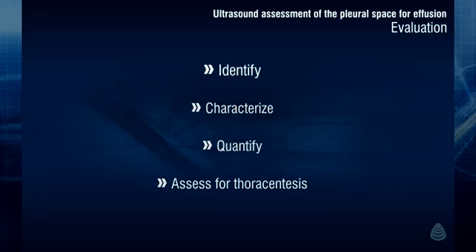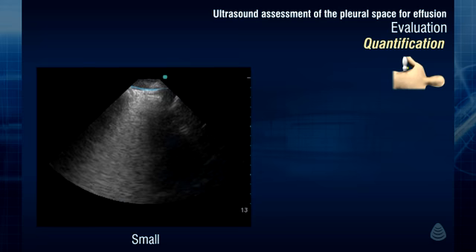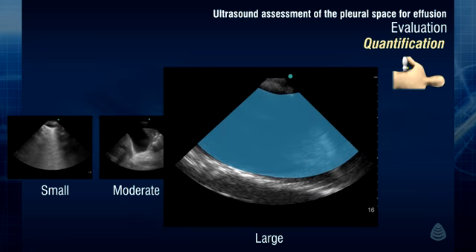In addition to the identification and characterization of a pleural effusion, the bedside sonographer should be able to perform a semi-quantitative estimation of the amount of fluid present. In most circumstances, it is sufficient to qualitatively judge a pleural effusion as small, moderate, or large.